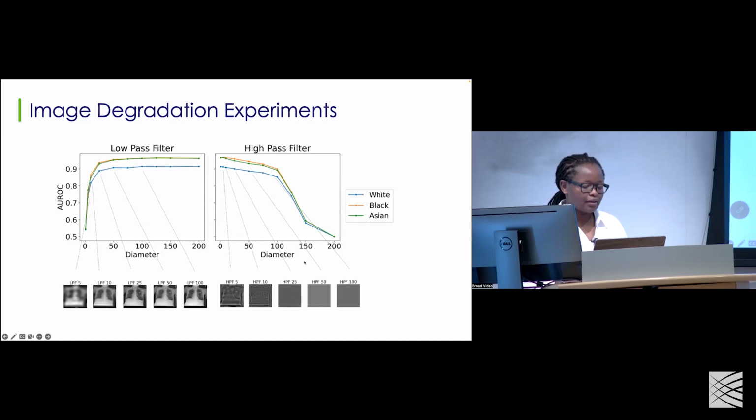And this work, which now nailed everything, I like to explain it. I haven't spent a lot of time on this experiment because he did it. It's like if you have TikTok and you can apply many filters in front of your image, it's the same thing we're trying to look at: could you look at the fine features versus the coarse features? And if you tell me that this high-pass filter of 100 is a chest X-ray, everyone in this room agrees that you can barely understand that this is a chest X-ray, but we still see the performance of around 0.86.